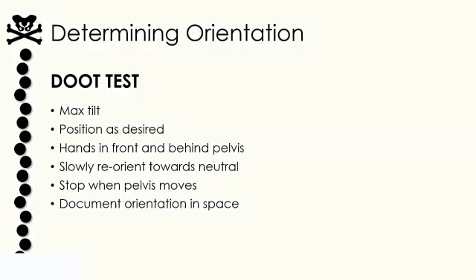All right. Once you document that, you're going to decide, is that an acceptable orientation for them to live their life? Okay. Early intervention, it might work out. Later intervention, that position is probably going to be still staring at the ceiling, and that position is not going to be very functional. So we're going to decide, is it an acceptable orientation or is it not?